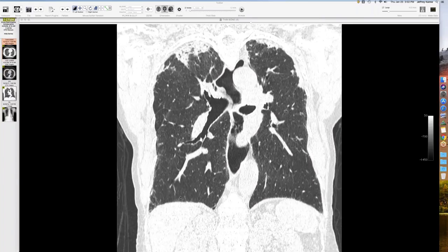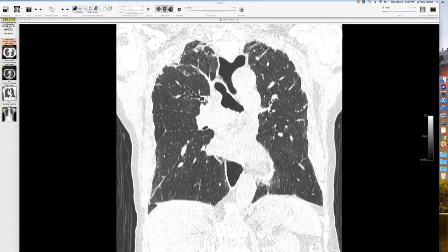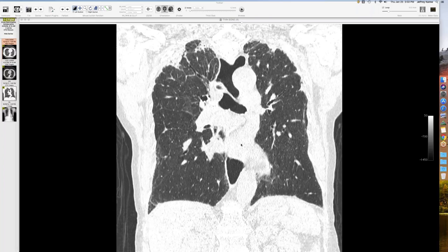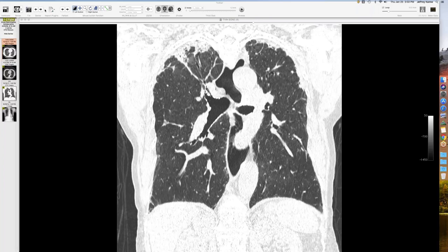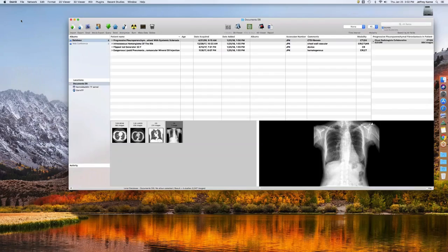No biopsy planned, but the imaging and progression fit pleural parenchymal fibroelastosis. We've been seeing this more and more — previously chalked up to age-related changes, but we're now recognizing it earlier: when there's a little too much involvement, extending centrally, with upper lobe volume loss features.